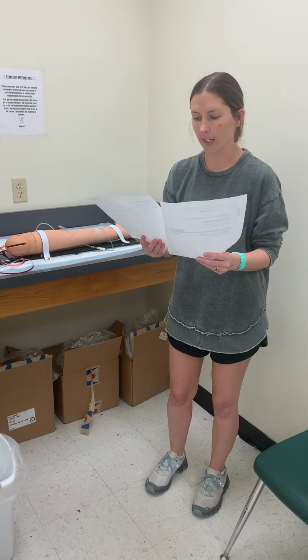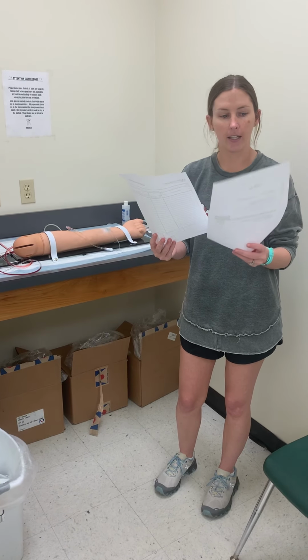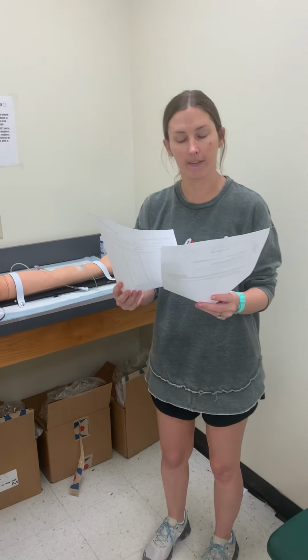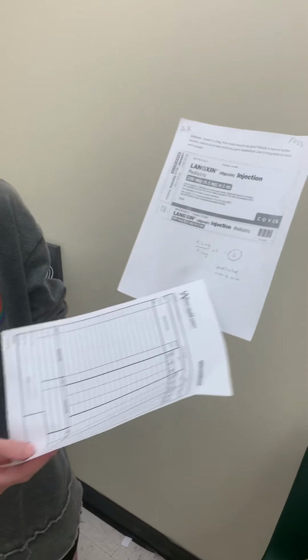I also want to check and make sure that my patient doesn't have any allergies, so I want to check that in the computer. I want to check that on my MAR and against my order and make sure they're not allergic to the medication that we're given. I've already worked my drug problem, and I'm going to be given 2 mLs of digoxin, and I'm going to be giving this over 5 minutes.